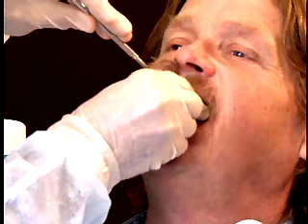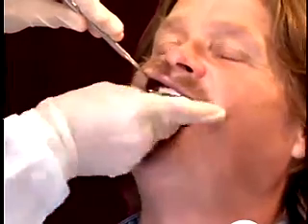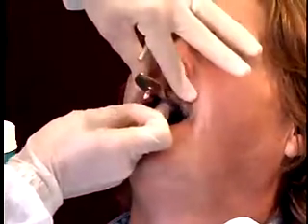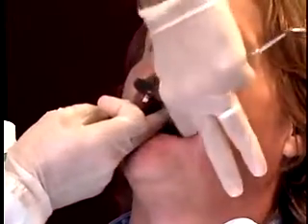At this time, elevate the upper lip so that the alginate flows into the labial sulcus. The seating pressure is stopped and border molding is performed so that the impression is not overextended.